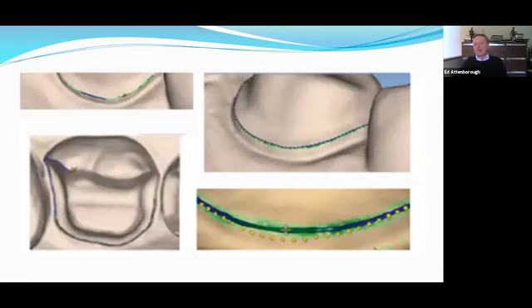And again, margin identification, software allows this to be done chairside or in the lab. I think it's no bad idea to verify the automatic margin identification chairside before you transmit the data to the lab, because you're in a position, you've got the patient in front of you. If there are any errors, as in bottom right here, where the software has not accurately identified the margin, you can then correct that before uploading it and save an awful lot of time and bother.